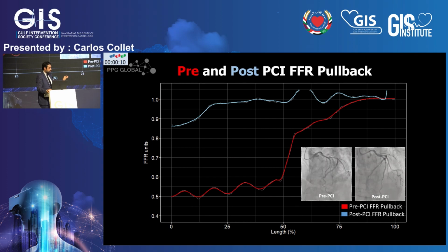Beyond the appearance of the calcified nodule, we're going to go back to that point. You see here that the FFR increased from 50 to almost 90. So we were happy with the functional result at the end.